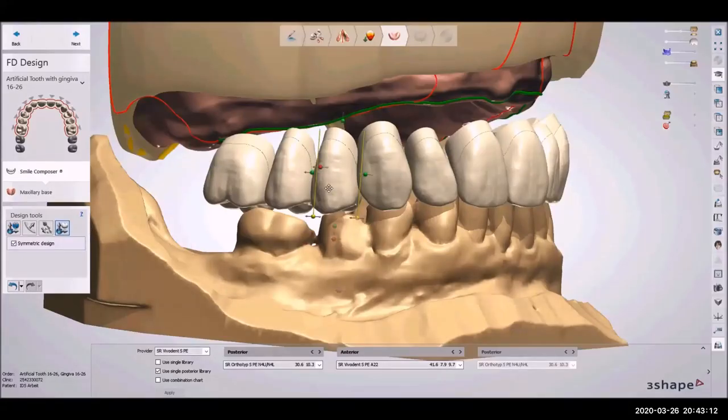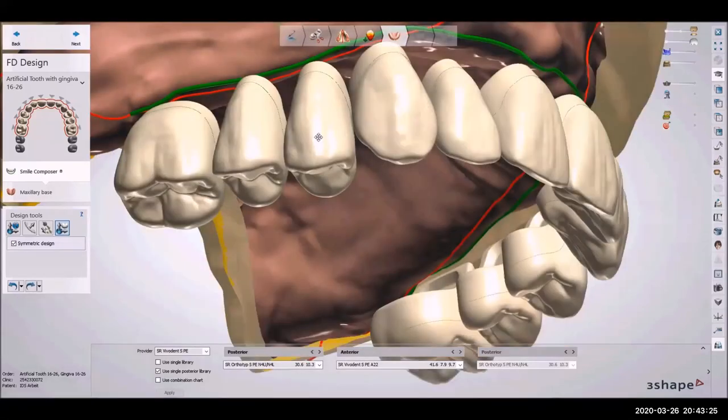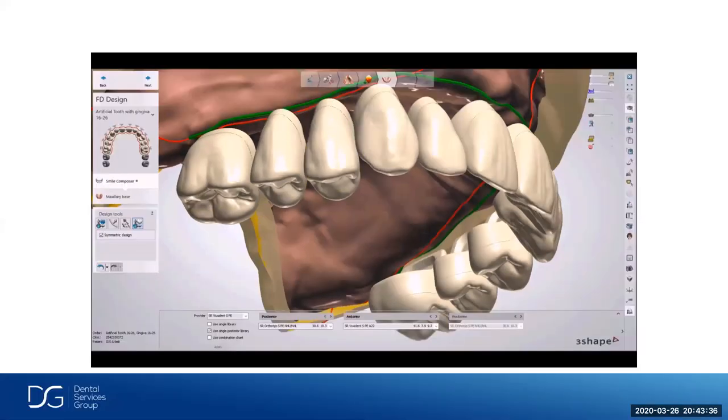Yes, so it's showing here, we're just bringing this tooth into occlusion, this bicuspid into occlusion. We can lengthen these teeth. We can make them a little bit wider. As you can see, we're widening the occlusal surface of this one tooth here. And there are a lot of neat tools in the software that we can utilize to plan these dentures.